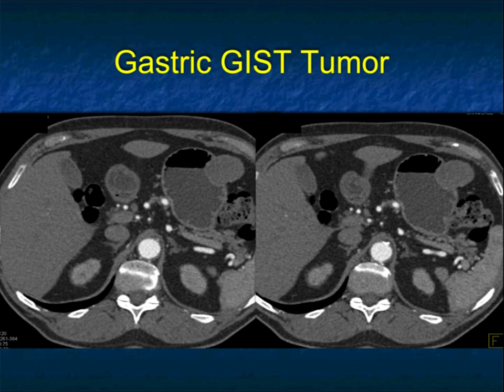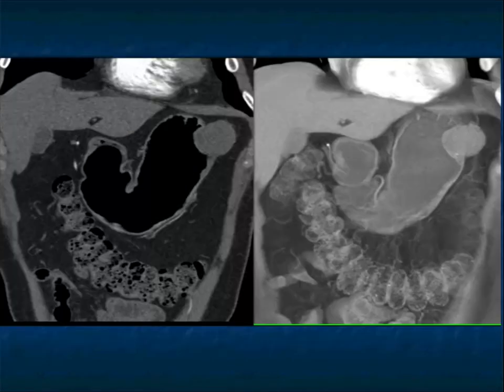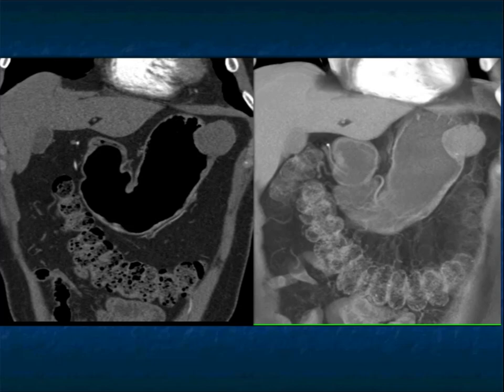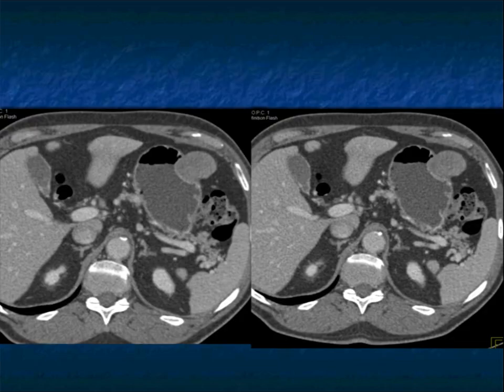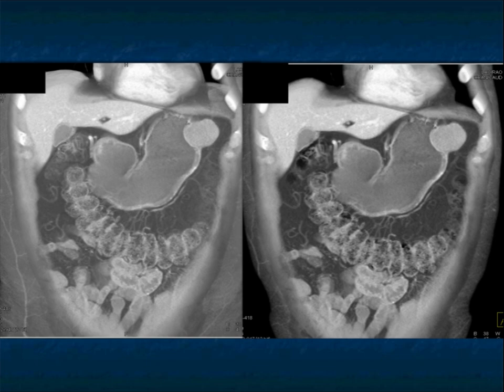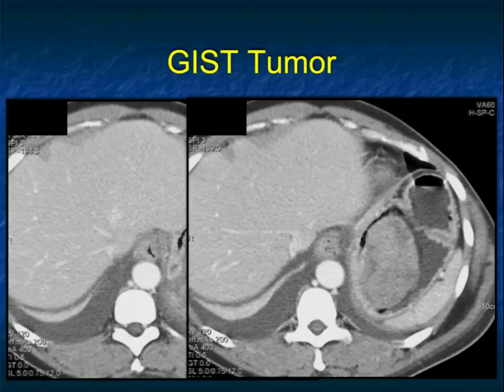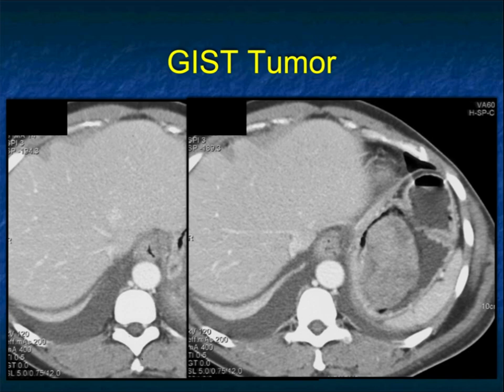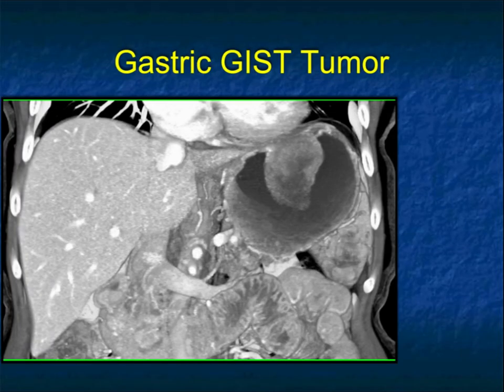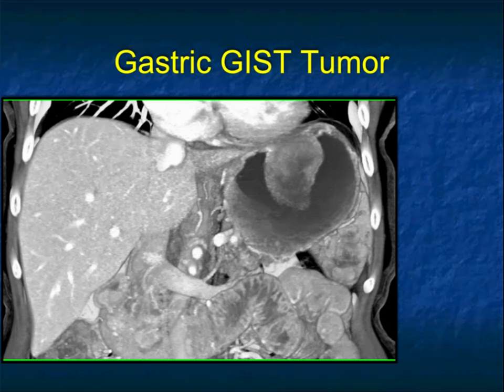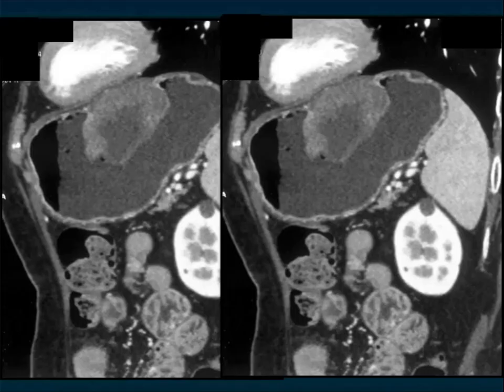Another example with both endoluminal and exophytic components. You can see different variables in terms of enhancement — they're usually not hypervascular. We see hypervascular lesions with small bowel GIST tumors; in the stomach there can be some vascularity but it's not very significant. Smaller lesions can be homogeneous, as in this case. This was probably the largest tumor I've seen with endoluminal components. What else could you think about? It's GIST — it doesn't look like adenocarcinoma or lymphoma. A big exophytic lesion with intraluminal component hanging down is going to be a gastric GIST tumor, though that's an uncommon presentation.